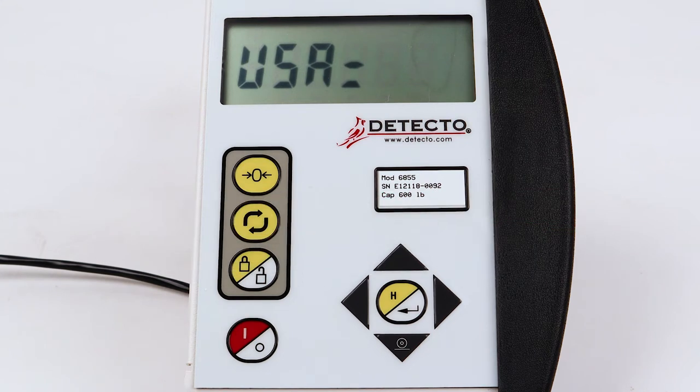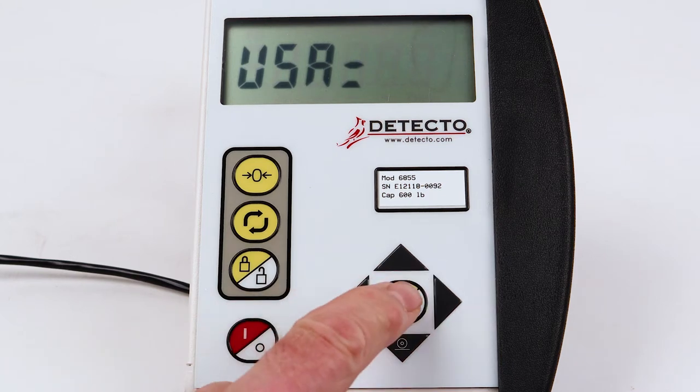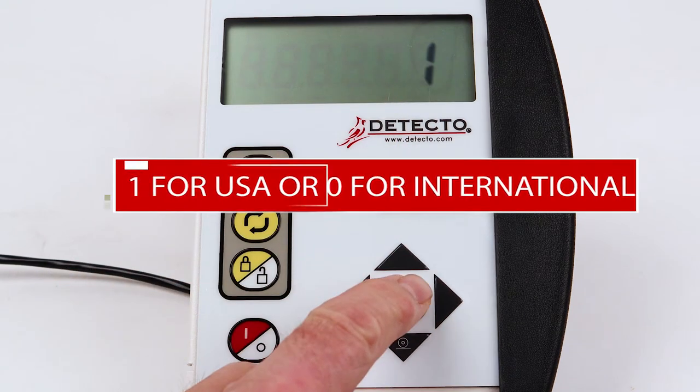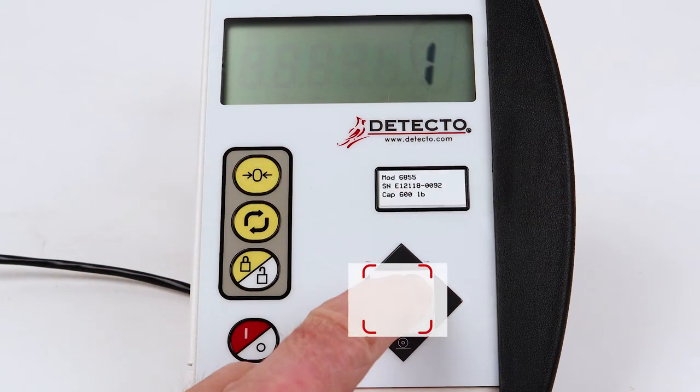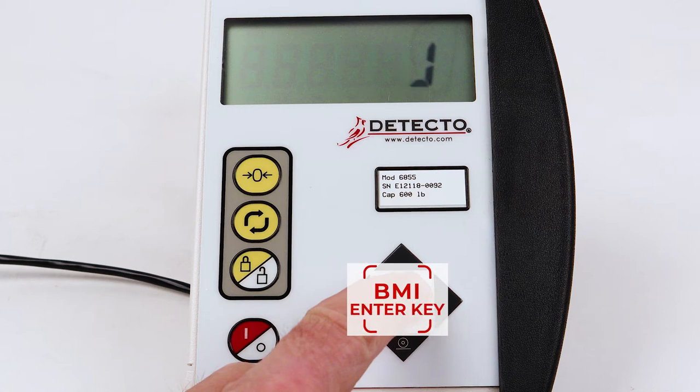The display will change to USA equal for the location usage setting. Press the BMI Enter key to show the current setting. If the setting is correct — 1 for USA or 0 for international — press the BMI Enter key. Otherwise, press the up or down arrow keys to select the correct setting and press the BMI Enter key.